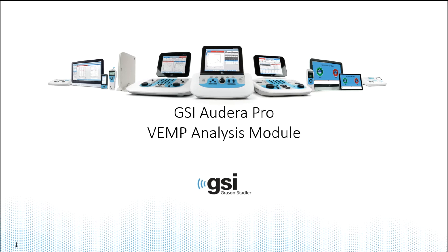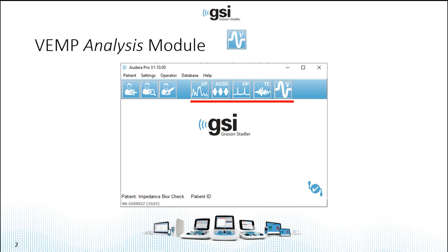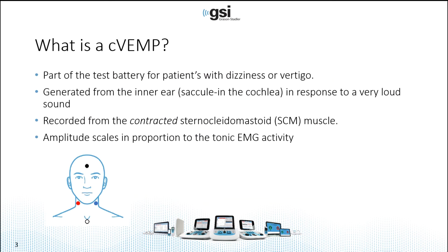Today we'll be talking about the GSI Audera Pro VEMP analysis module. The VEMP analysis module will appear on the opening screen of the Audera Pro software. It's different than the four test modules in that you only access the VEMP analysis module when you're done collecting your C VEMPs or OVEMPs and you need to analyze. Today we're going to cover how to use the VEMP analysis module, and briefly before we do that, I want to cover a few things on C VEMP and OVEMP.